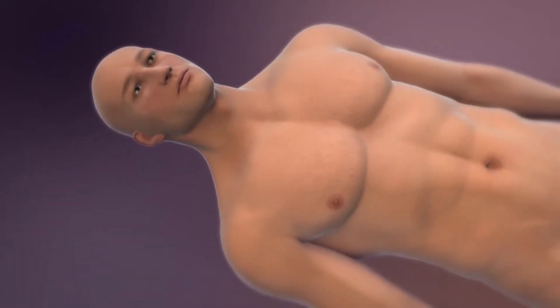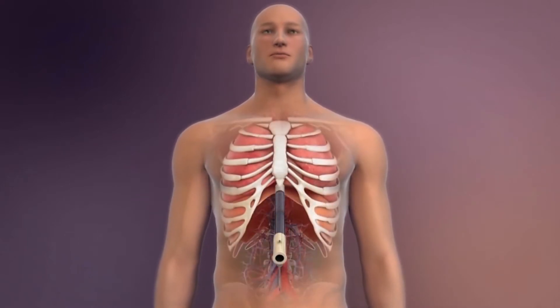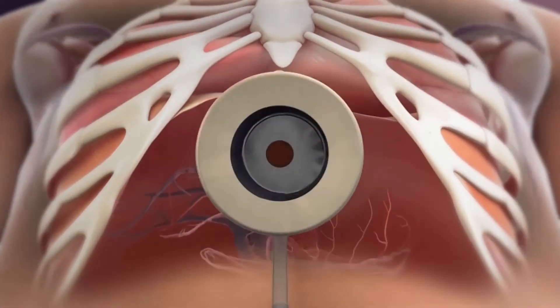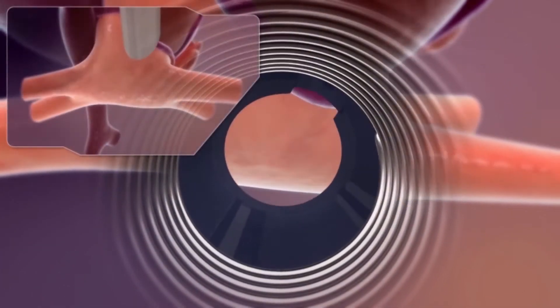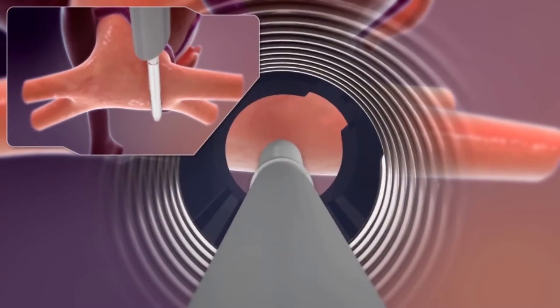Let's look at a cartoon video of how this procedure works. The surgeon starts by passing a scope up under the xiphoid, below the sternum, to the heart. This is the view he gets of the back of the left atrium, and that's what the four pulmonary veins look like coming in.